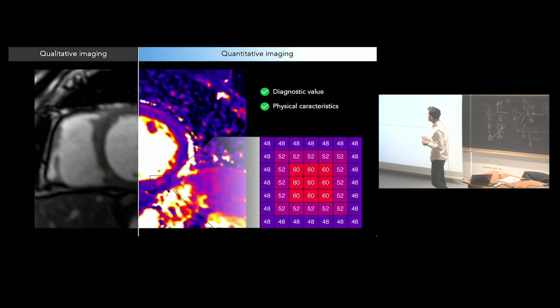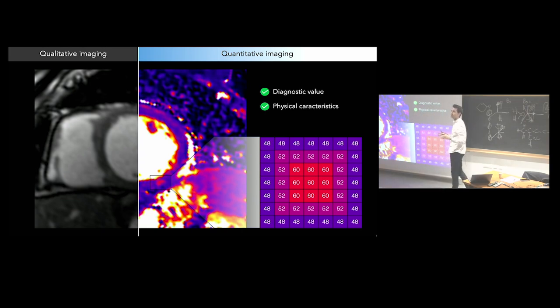Now we need to know the size of the inflammation. And T2 mapping is great. For the last 10 or 15 years, we were using qualitative imaging, black blood imaging, but now we are using T2 mapping. T2 mapping is very efficient in the field of cardiac MRI. Each pixel has a physical sense, in milliseconds. We saw the mapping yesterday, so we use it for cardiac MRI.